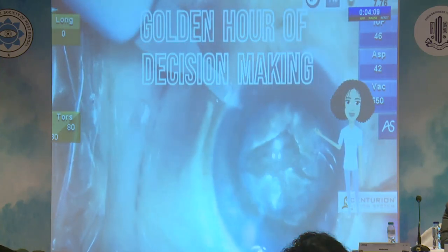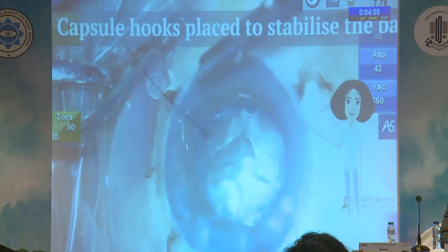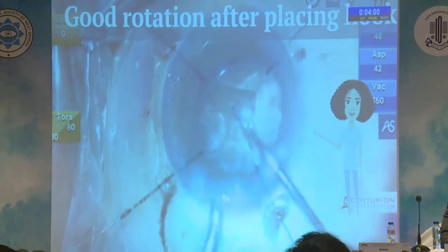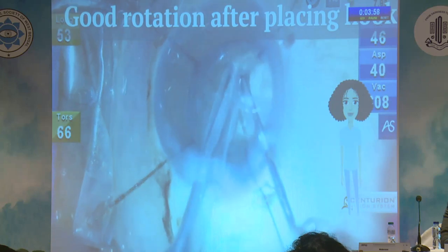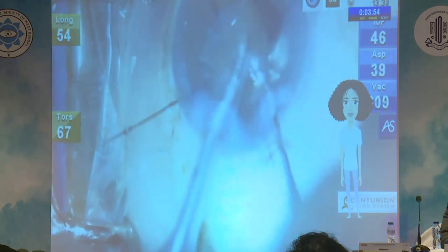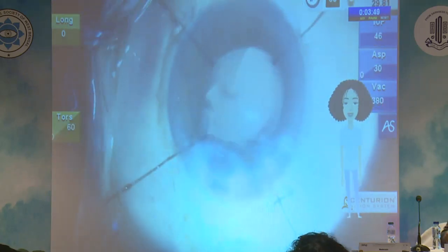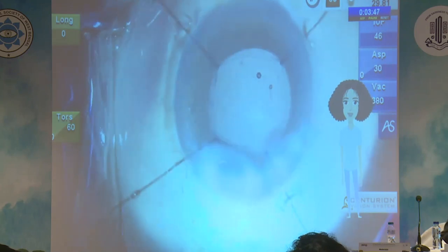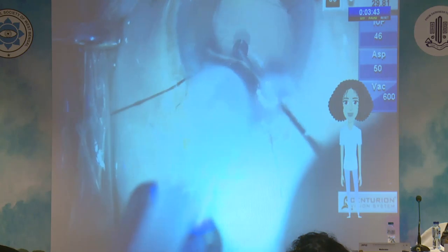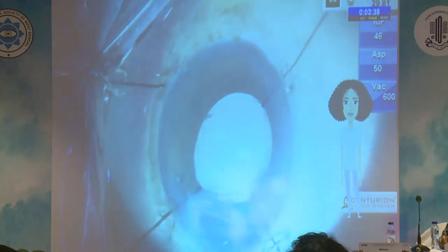This alerts the surgeon. Yes, yet another golden hour. He reassesses the situation and decides on placing capsule hooks. After placing the capsule hooks, the nucleus rotates freely and the rest of the surgery is completed effortlessly. What could have been a larger zonular dialysis was prevented by the surgeon's early identification and timely management.